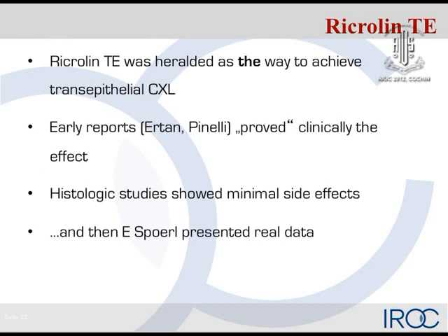Why do we still remove the epithelium? Can't we do a transepithelial cross-linking? Remember that 2 years ago, Ricrolin TE, transepithelial, was heralded as the way to achieve that procedure. And early clinical reports from Dr. Ertan from Turkey and Dr. Pinelli from Italy proved clinically that transepithelial cross-linking would work.